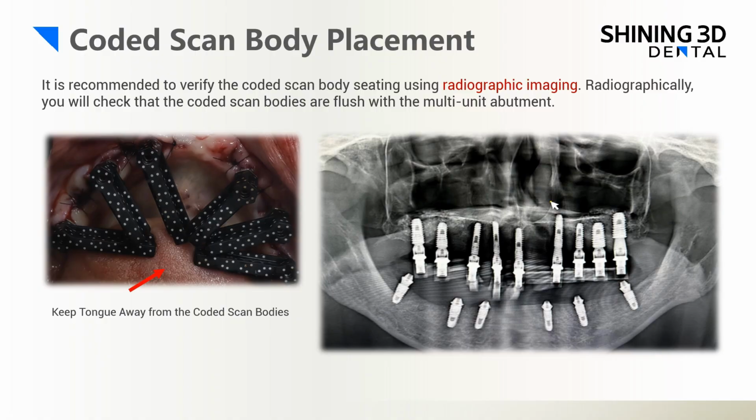When mounting scan bodies in the lower arch, remind the patient not to press their tongue against the scan bodies, to make sure it will not move them and affect the accuracy. Help the patient keep their tongue away from the scan bodies during the scanning.